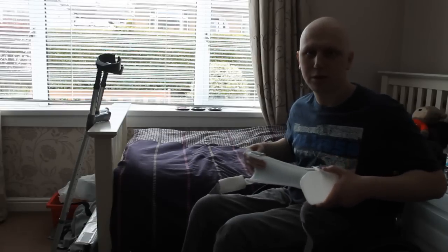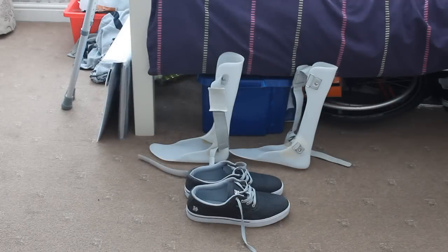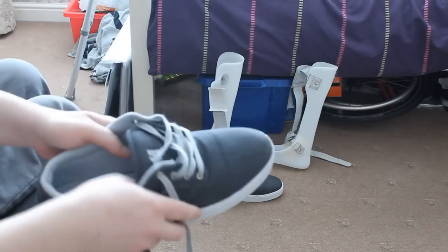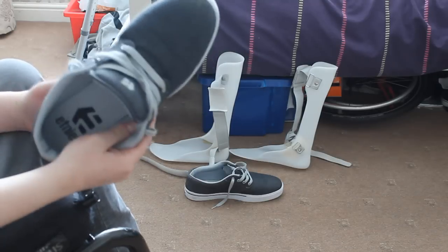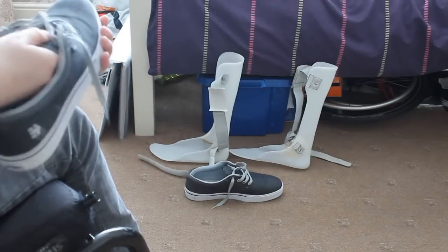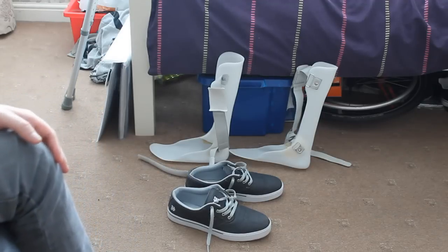I'm going to put the splints on just now and I'll re-angle the camera so you can see me do that. Here are the leg splints and the shoes that I use. The shoes are just a standard pair of casual shop shoes — these are branded shoes, I just bought them at a store. They cost about £40 or £50, which is the regular price for a pair of shoes these days. They are just really standard casual shoes that I can wear with the splints and they just go right on.